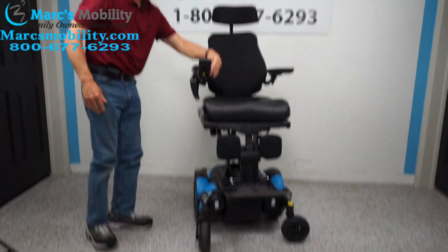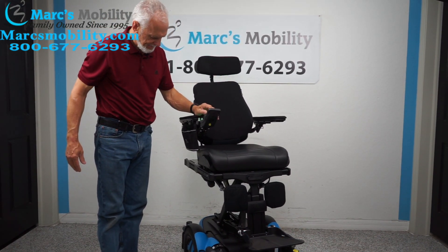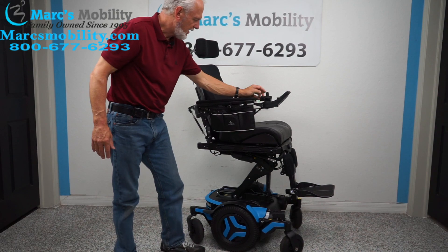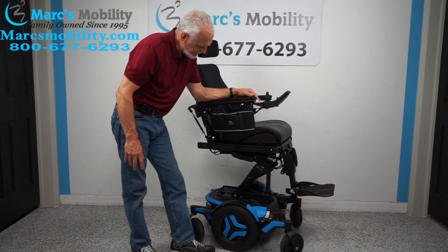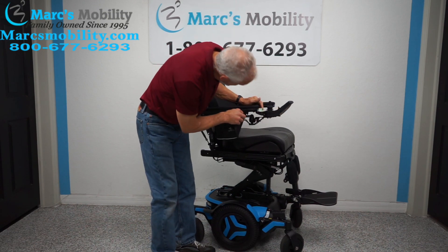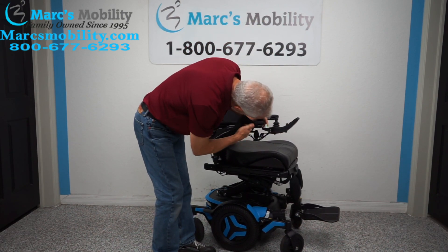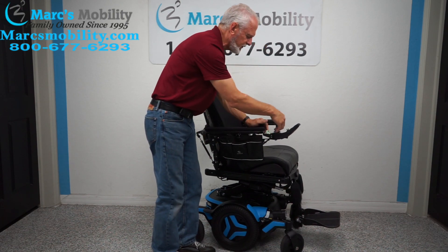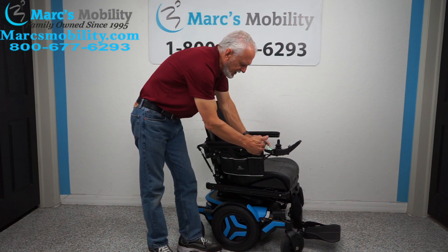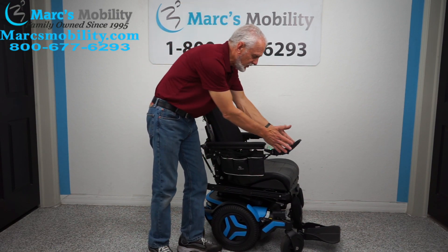Let's bring the chair back over and turn the power on — give it a second to reset. Now let's bring the seat lift back down. While it's going down, you can see there's a swing-away joystick here. It's sitting a bit close to the arm right now, but you can bring the joystick all the way over to reach a dining table. If you're left-handed, we can put the joystick on the left and it'll swing to the left.